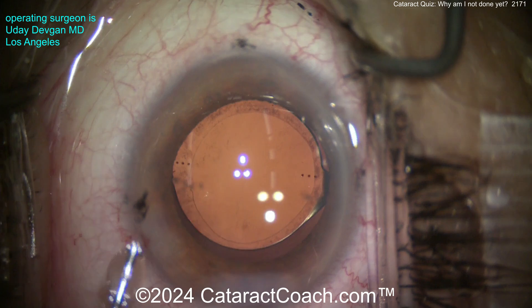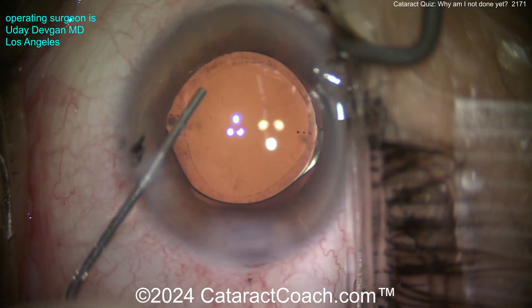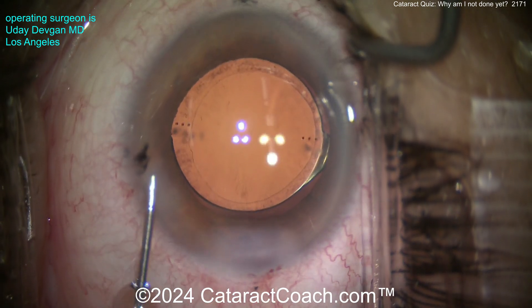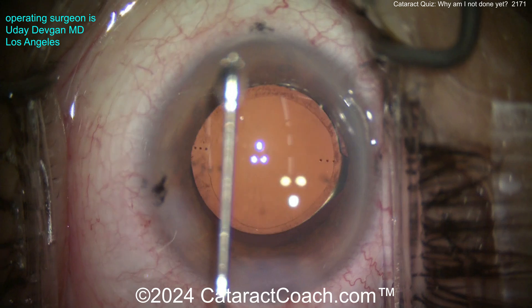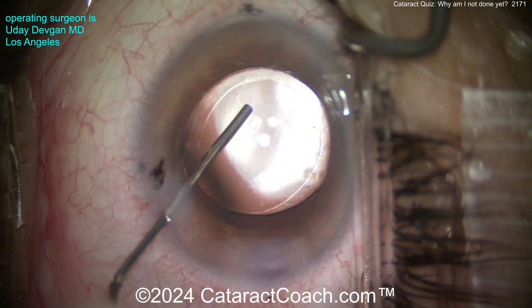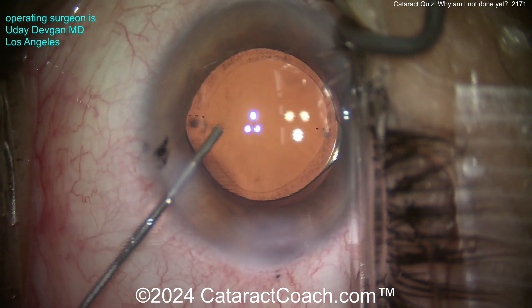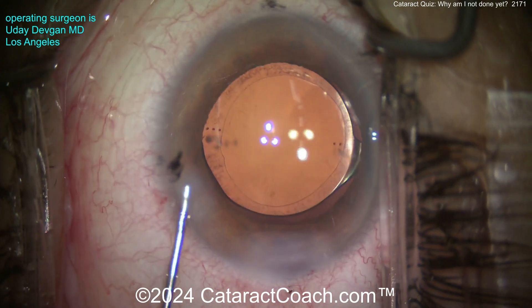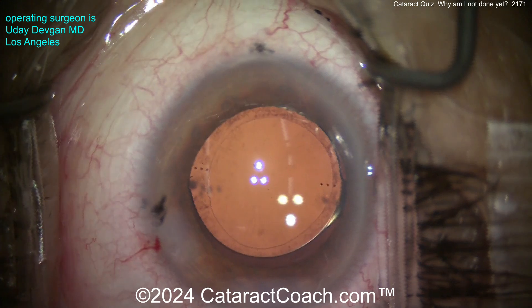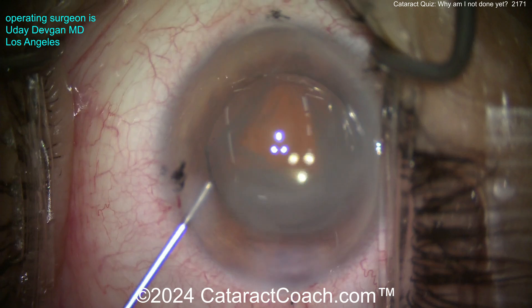It's pretty common to have a retained lens piece after routine cataract surgery. We break the cataract into many little pieces, emulsify them, and aspirate them out. Sometimes a piece is hidden under the iris, the pupil doesn't dilate well, or a piece is stuck in the sulcus or the angle of the eye. It can be hard to see depending on the cornea or the color of the iris — you have to look very carefully and vigilantly.